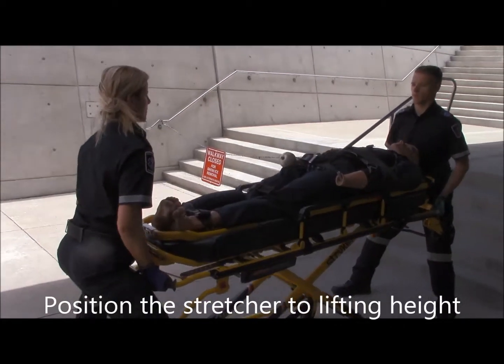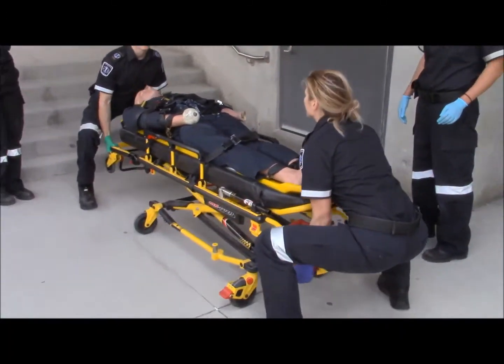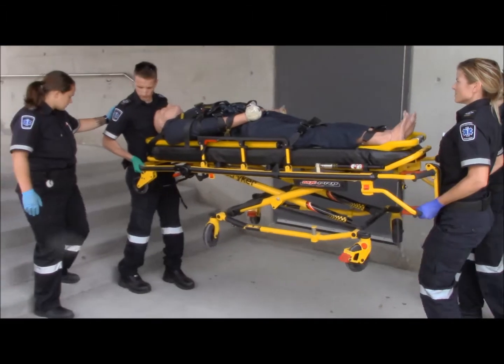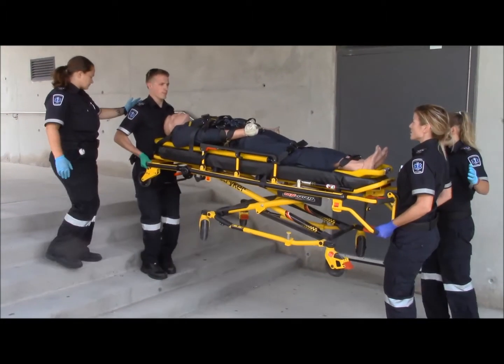The fourth and typically most difficult stage is the porch lift. At this stage, you'll be required to lift the mannequin, the breakaway stretcher and the operational stretcher up a small set of stairs. You'll notice the paramedic students have dropped the stretcher so as to allow the carriage to clear the stairs during the ascent and descent.